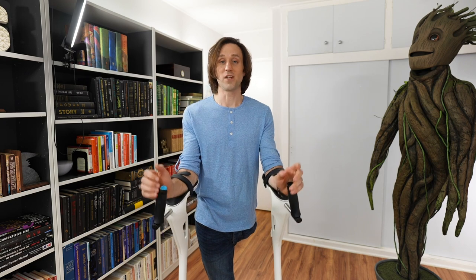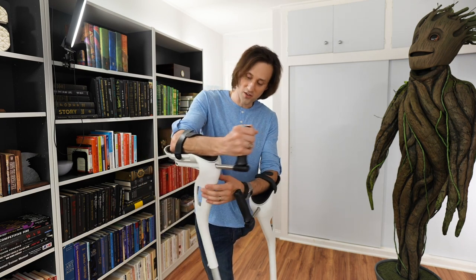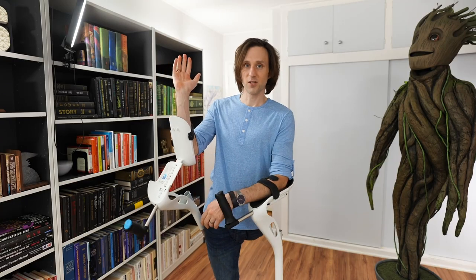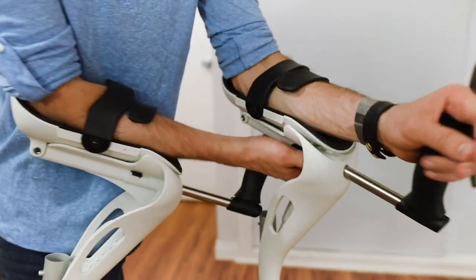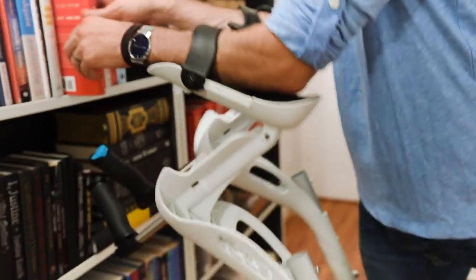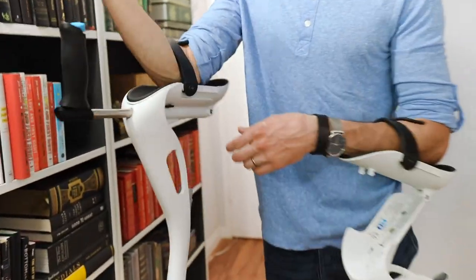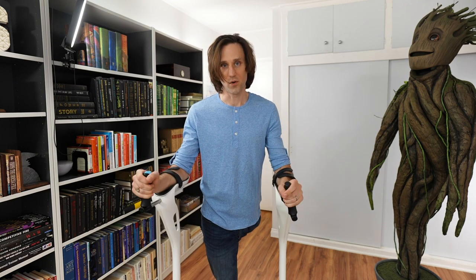But more interestingly, what if you need to lift your hands out to grab something from a shelf? Under here, there's a little button — a locking and unlocking mechanism. You can just flip that back and suddenly your forearm is free. Do that on both sides. And now you can reach things, grab things, etc. Then you just go back up here, lock that back into place, and lock this one back into place. And voila, we're now back solid.